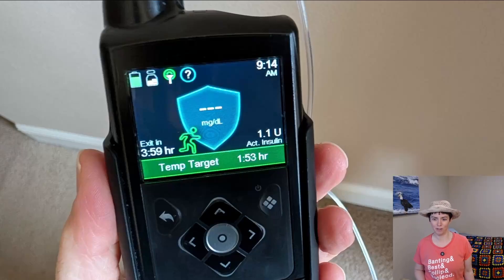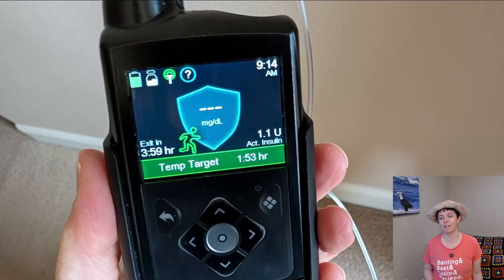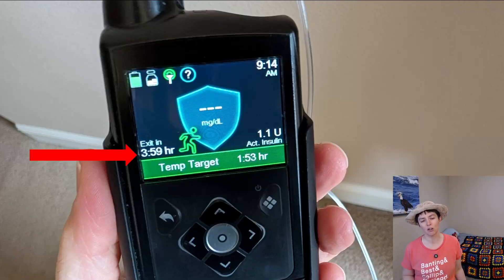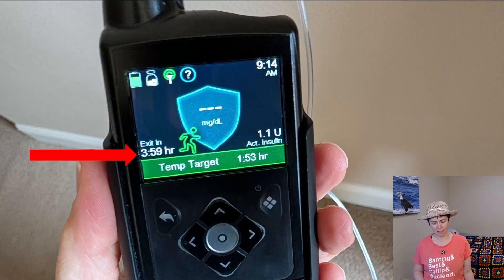CGM sensor failure — the recurrent, most common problem in today's insulin pump and diabetes technology. If you're watching this video because that's what you're dealing with, your situation is probably worse than what is shown here, because in this case the sensor reading was only unavailable for one minute. You can see in the corner it says 'exit in 3 hours 59 minutes.' This is the MiniMed 780G insulin pump, and if you are in SmartGuard mode, it starts counting down from 4 hours as soon as it does not have a signal.